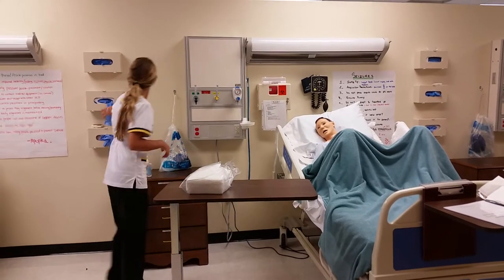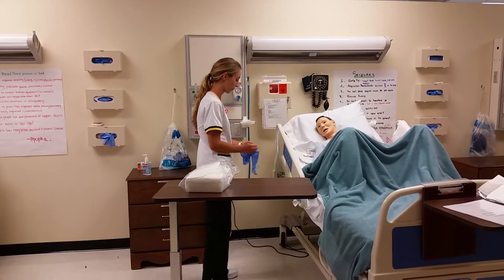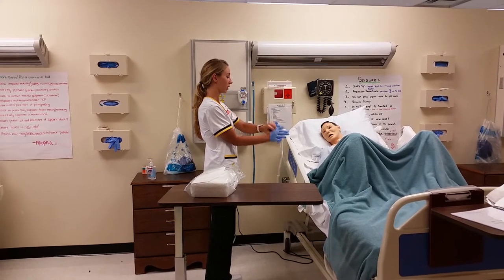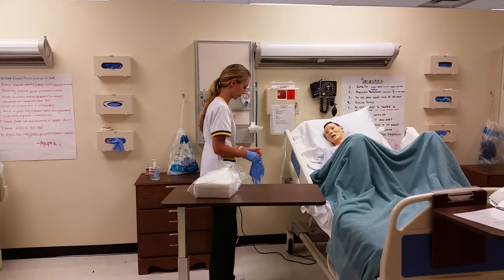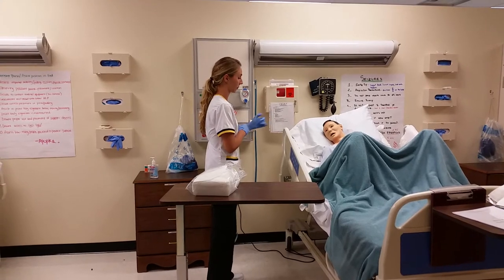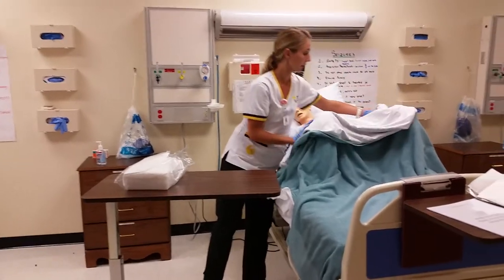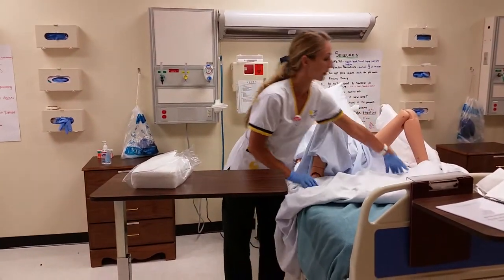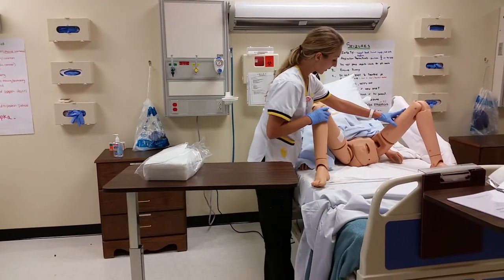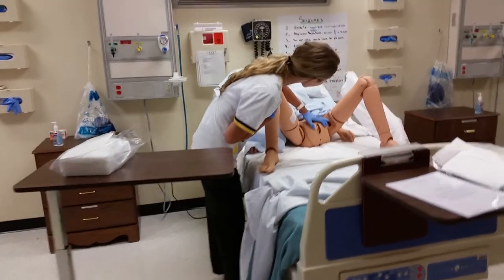Well, I have an order here for an indwelling catheter. You've been having some urinary retention, so I'm going to go ahead and set that up. But first, I need to assess your perineal area. I'm going to go ahead and put some gloves on. Okay, so the perineal area has been cleaned, and I have identified the urinary meatus and the urethra opening.